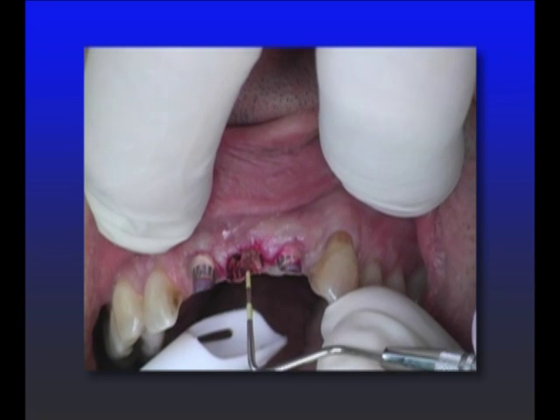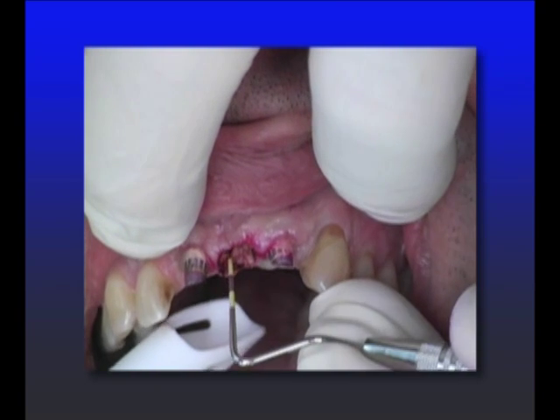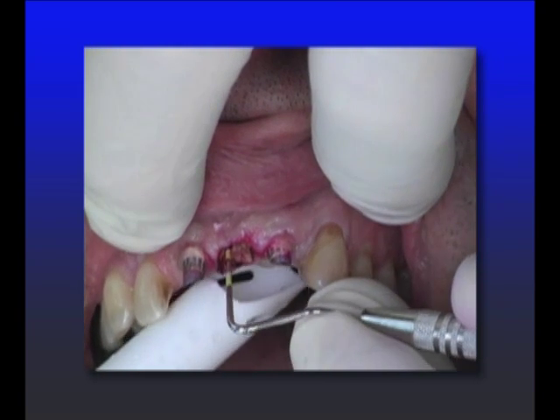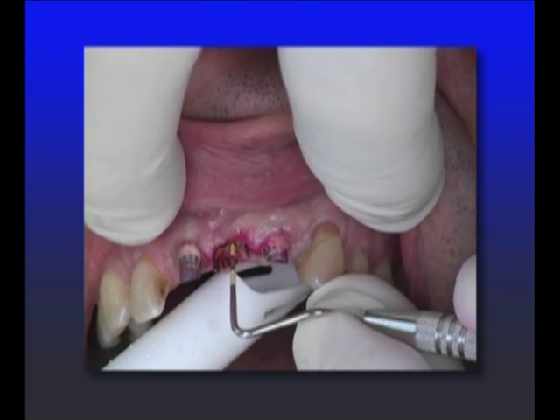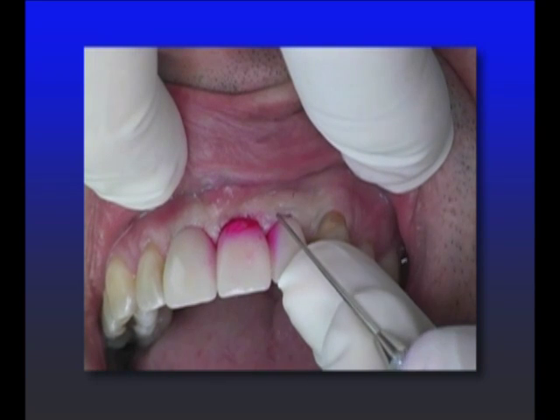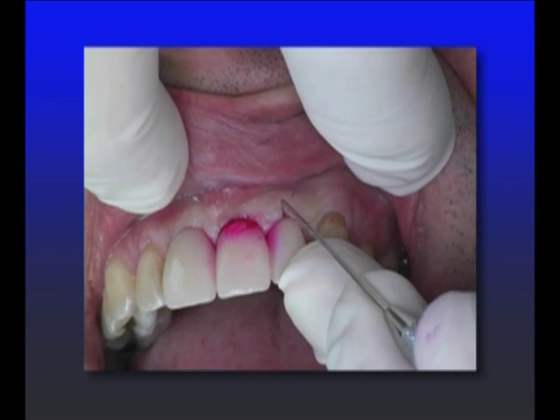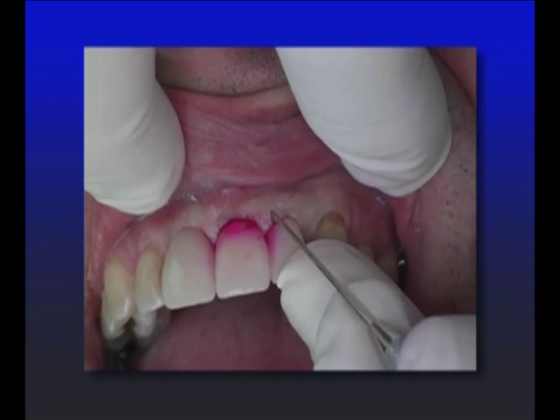Here what I'm doing is measuring just to get a sense for tissue thickness, because I know I want to leave at least two millimeters of tissue over the bone. But in an area that's been grafted like this, typically bone isn't a problem — there's not bone in the way. Just checking to be sure the margins are actually down all the way before we go in and do the temporary cementation of this bridge.